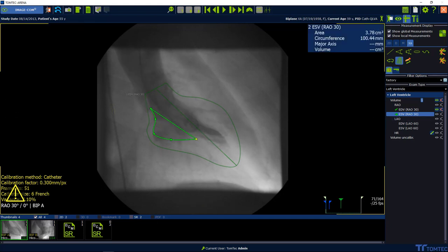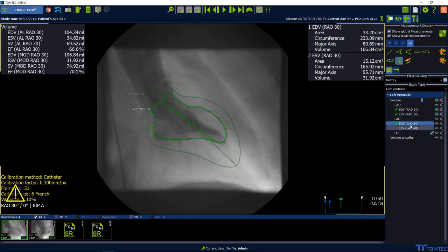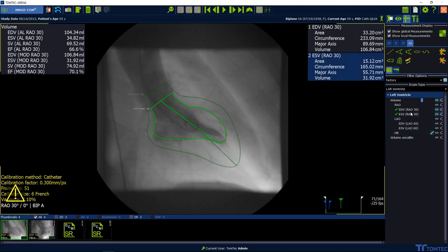Then move the mouse out of the workspace to visualize the values in the upper left-hand corner. To calculate the bi-plane ejection fraction, proceed with the second plane now and follow the same steps as before.